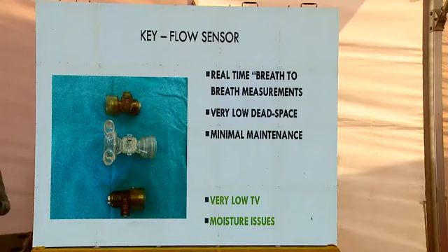In adult ventilators, it is usually inside the ventilator machine. So in adult ventilators, you know that the tidal volume is large, like in one breath we are taking 500 ml of volume, and the circuit volume loss or the compressible volume loss is not much as compared to 500 ml.